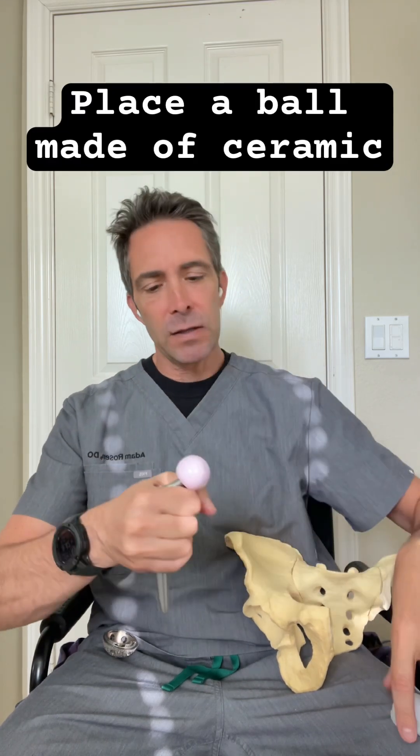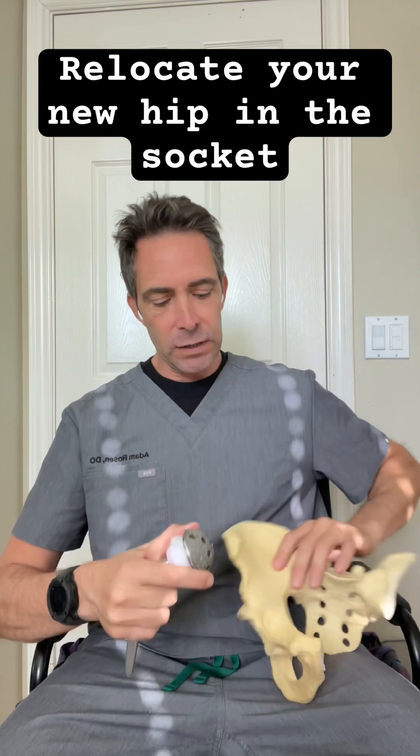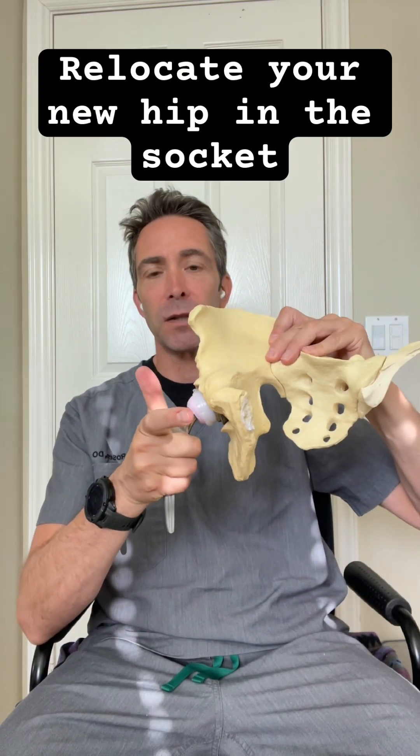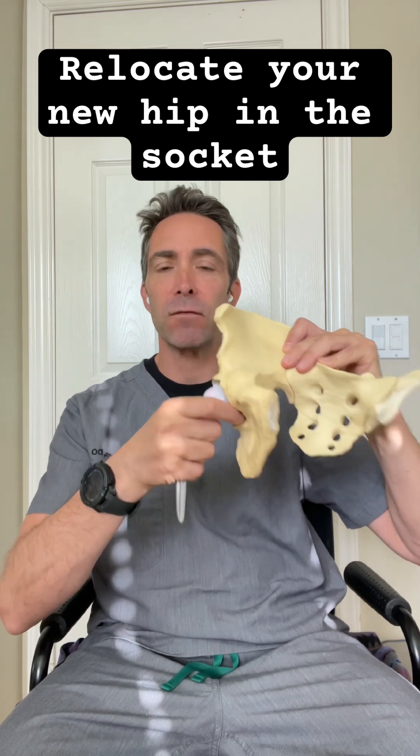And on top of the neck, we would then place a ball, typically made of ceramic, that would go on top of the implant. And then this would get relocated back into the plastic liner, which is inside the metal shell, which is inside your cup. And this becomes the new hip replacement that allows you to walk and stand and decreases the pain that you've been suffering with from your arthritis.